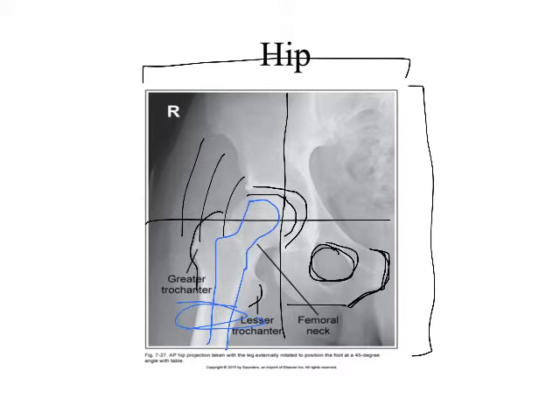So, in terms of patient care, we need to be asking patients, have you had a hip replacement? Is there any hardware in your hip? Now, a nice cheat is if they have had a hip replacement, if they're post-op, you can pretty much shoot from the top of the bandage down to the bottom of the bandage, you've probably got what you need, right? Okay.